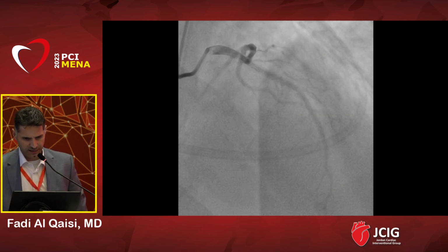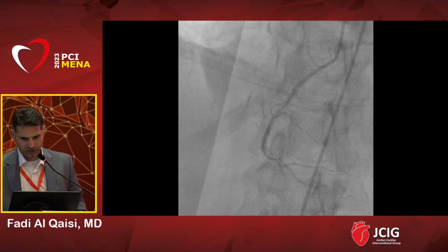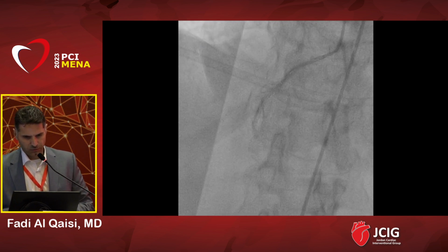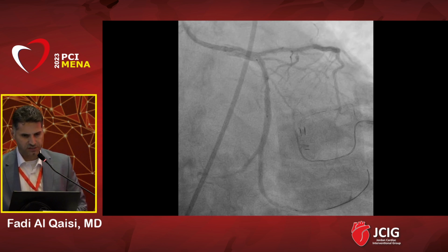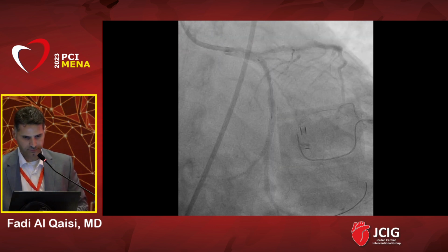This is her RCA that has also patent stents. We treated with one drug-eluting stent, 3.5. This is the position and testing while the balloon is up, showing patency into the LAD away from the ostium. This was the final result when she left in September 2022, a few months ago.